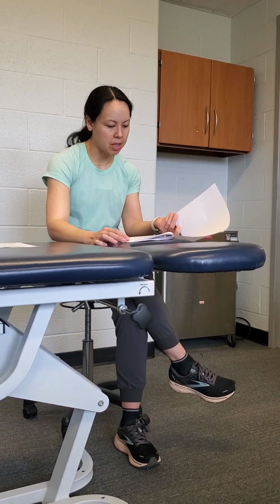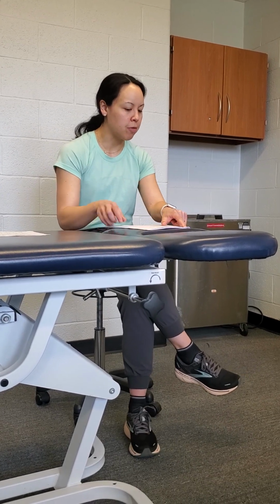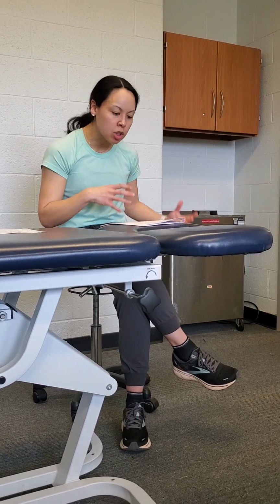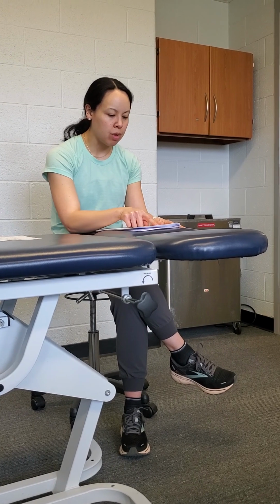Exactly. And actually, this brings up the next section, which is doing BFR in combination with neuromuscular e-stim. So you can certainly pair them together, and the studies have shown that.